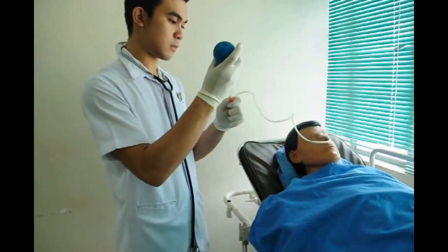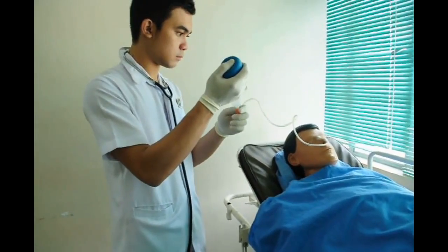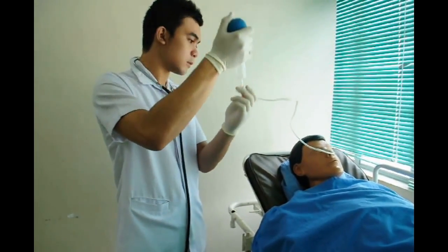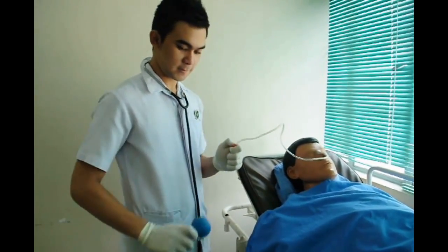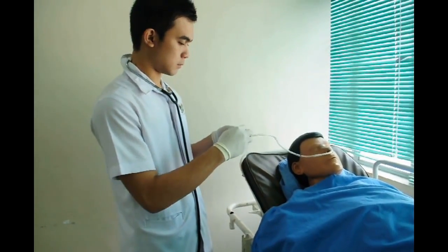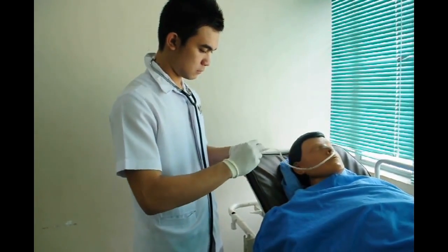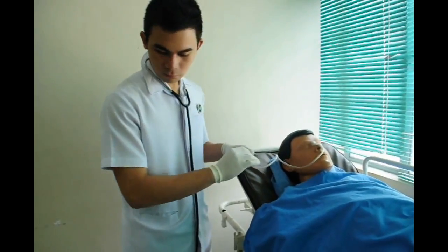This is to check if there are residues left from the last feeding. Okay, good. There is no residue from the last feeding. Aspirate all gastric contents with a syringe and measure to check for the residual amount of feeding in the stomach.